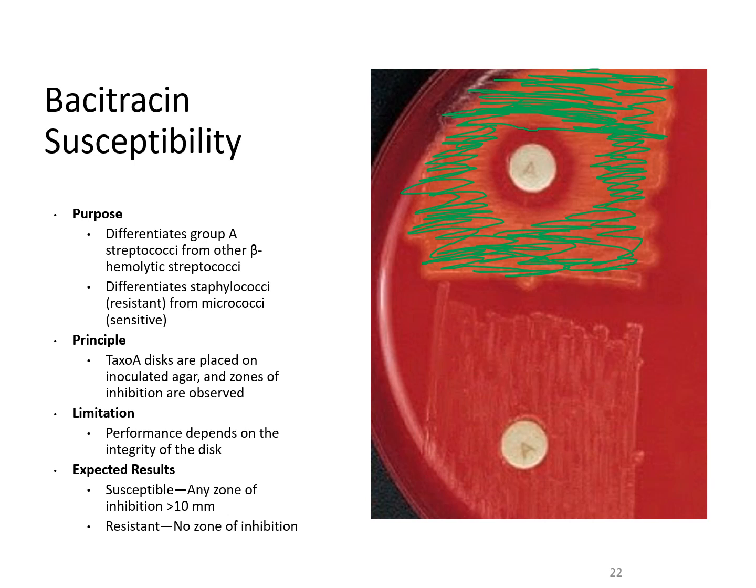Once you've inoculated it, you would place a paper disc that has the antibiotic impregnated inside of it onto the plate. You would incubate this plate overnight, or 18-24 hours, to allow that organism to grow.